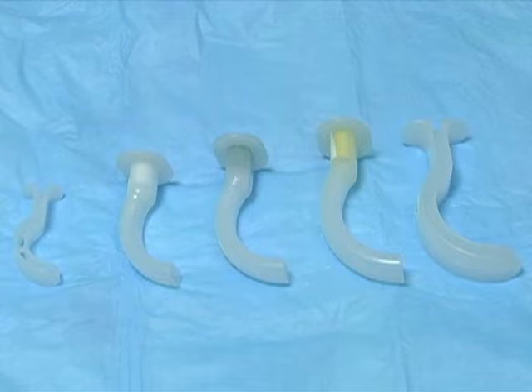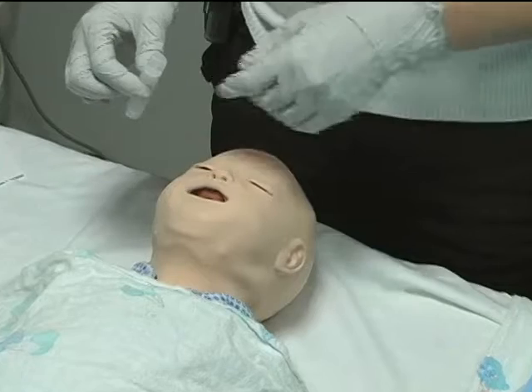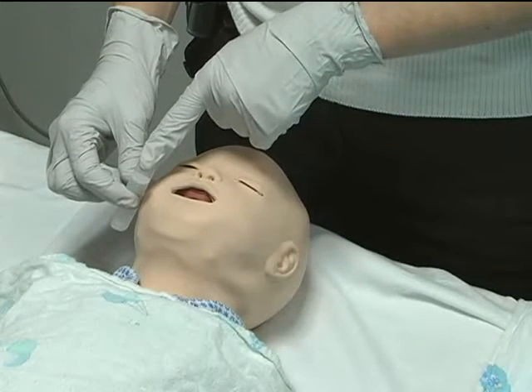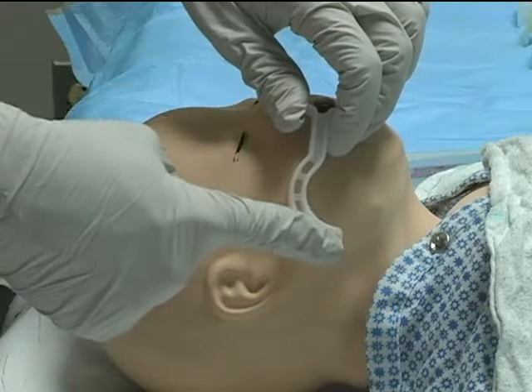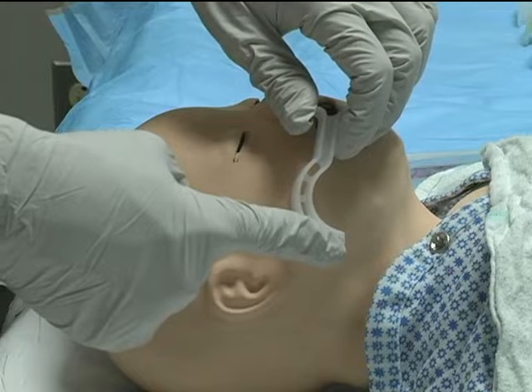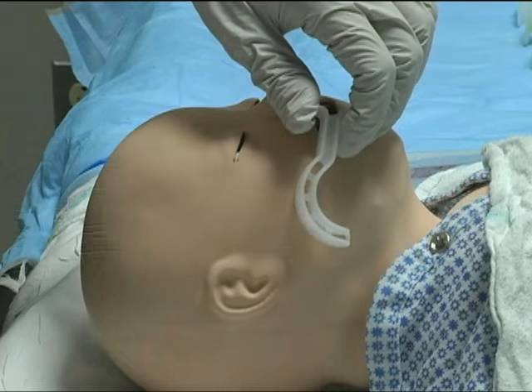An OPA should only be used if the patient is unconscious or minimally responsive, as an OPA may stimulate gagging, which poses a risk of aspiration. Choose an OPA of the appropriate size. To determine the appropriate size, hold the oral airway beside the patient's mandible, orienting it with the flange at the patient's mouth and the tip directed toward the angle of the mandible. The tip of an appropriately sized OPA should just reach the angle of the patient's mandible.